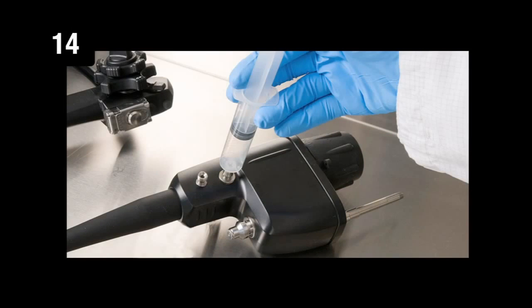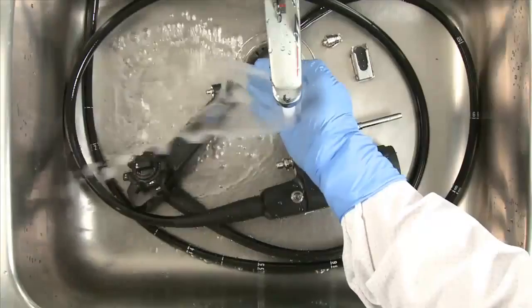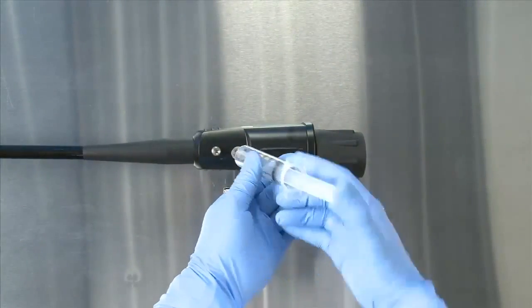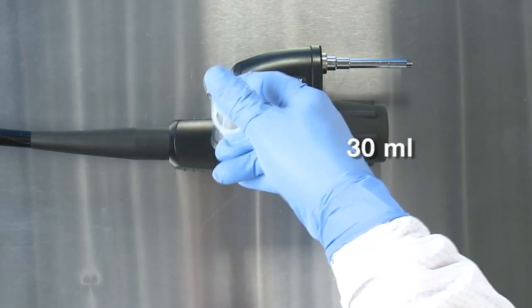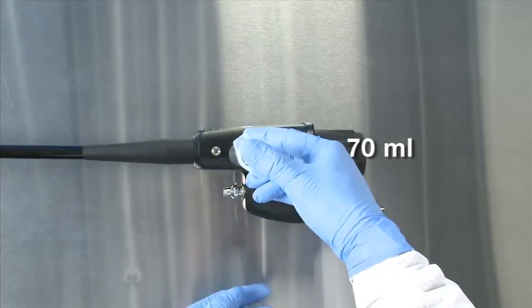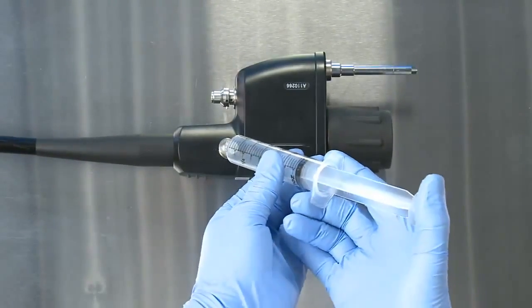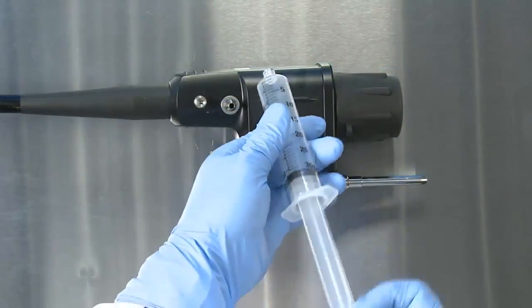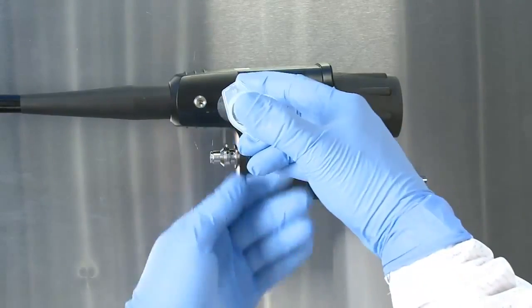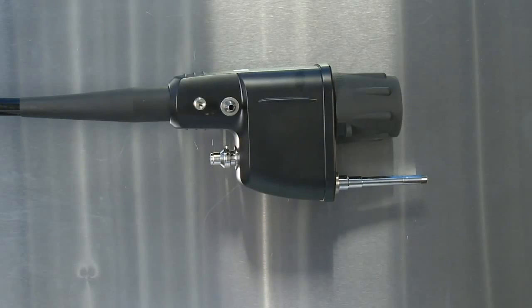Step 14. Alcohol rinse and air drying of endoscope channels. After a sterile bacteria-free water rinse and air purge, flush 70% ethyl or isopropyl alcohol through all channels, 30 milliliters for the air-water channels, 70 milliliters for the suction and instrument channels. Immediately follow alcohol purging of all channels with forced air to dry, using either an empty syringe or compressed air. If compressed air is used to purge the channels, the pressure of the air must not exceed 24 psi.